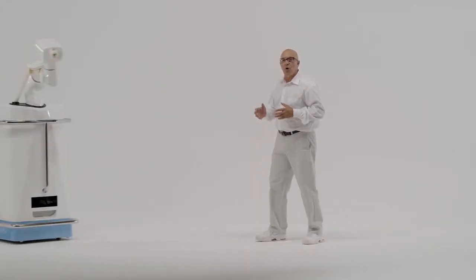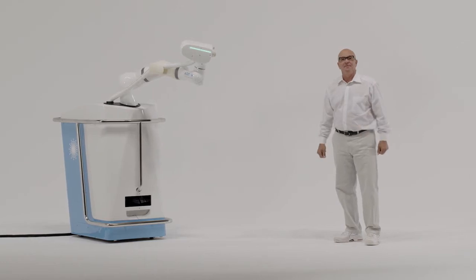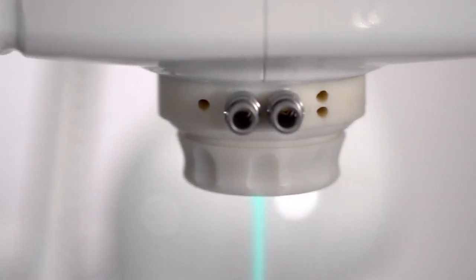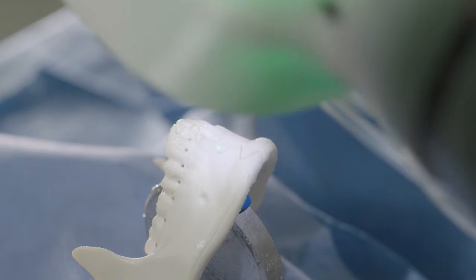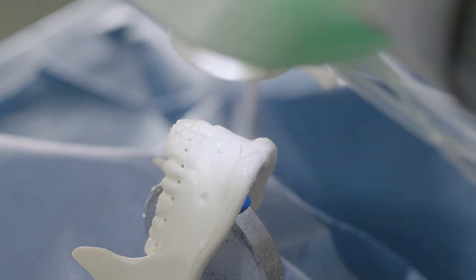CARLO stands for cold ablation robot-guided laser osteotome. With the laser osteotome, we can cut any desired shape. The cuts do not stress the tissue thermally and, as shown, can be performed in such a way that the cut pieces will achieve immediate stability when reassembled as an interlocking whole.